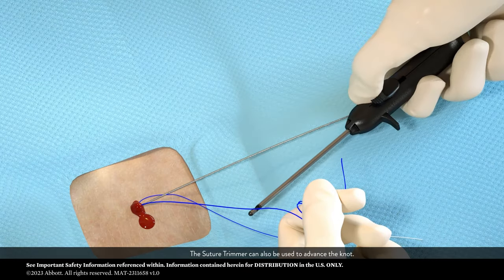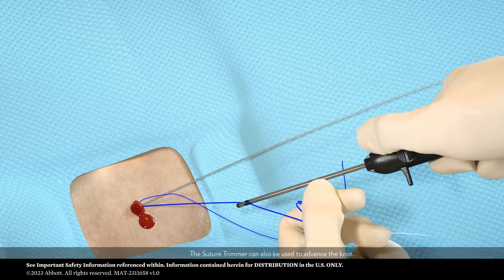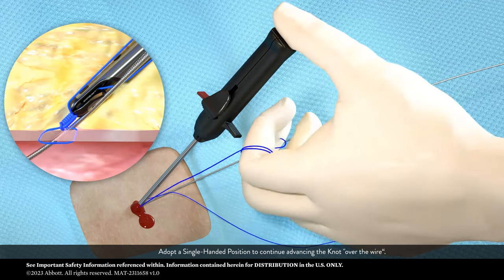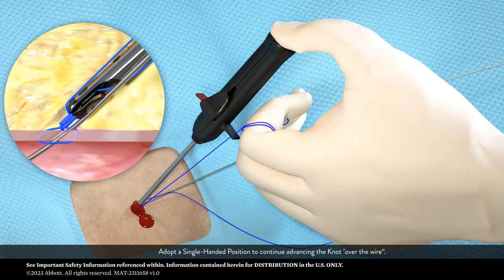The suture trimmer can be used to advance the knot. Adopt a single-handed position to continue advancing the knot over the wire. Apply slow, consistent increasing tension.